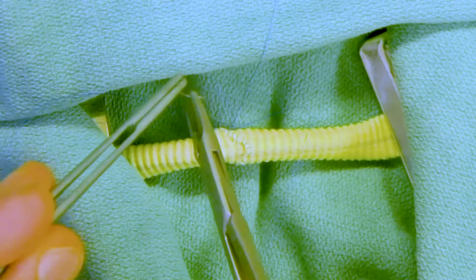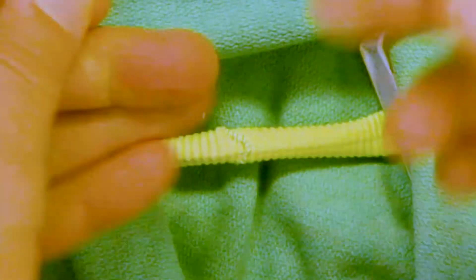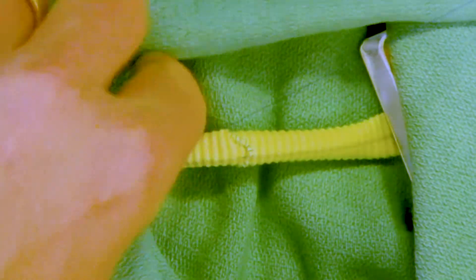Lastly, you want to secure your suture line with a properly tied knot. Initially, it will start off with a slip knot and then lock that with at least five throws of suture.